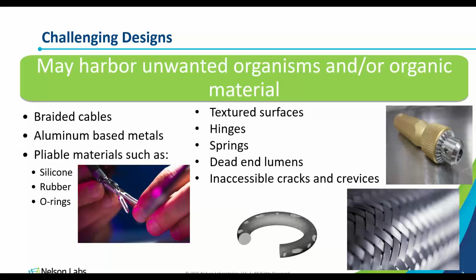So really, in your instructions for use, you just need to have language that dictates that the device is dry before packaging it or before the next step, whatever that next processing step is, whether it's disinfection or sterilization.